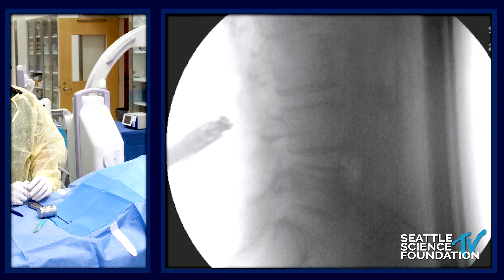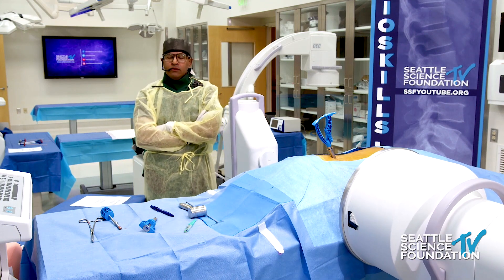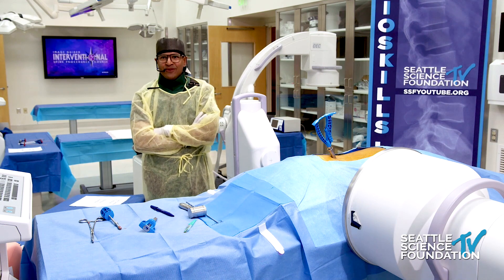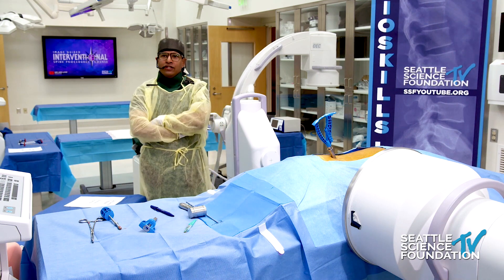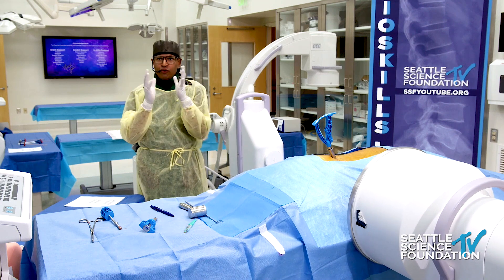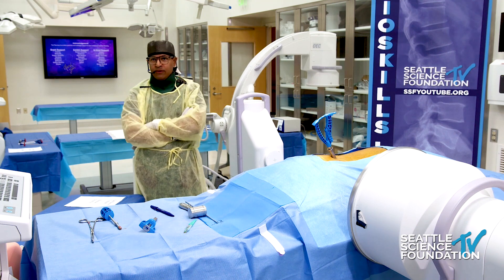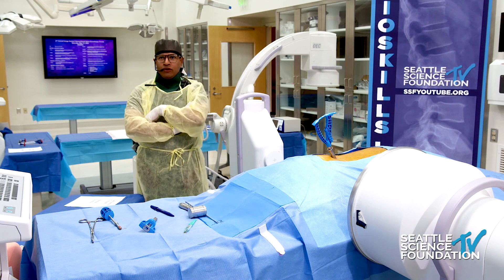One question: you mentioned moderate stenosis — how would you identify patients with moderate stenosis? A 25% to 50% reduction in area compared to the adjacent level is the NASS definition. As a personal check, I look at the CSF-to-nerve-root ratio: if all nerve roots are constricted with no CSF, that's severe stenosis; if you see a one-to-one ratio of CSF to nerve root, that's moderate; if you see more CSF than nerve root, that's mild.